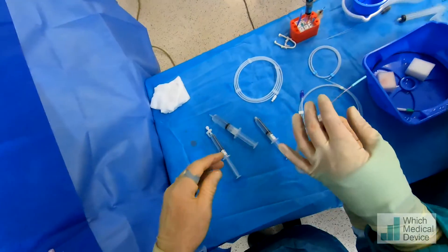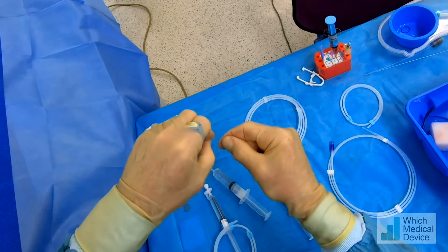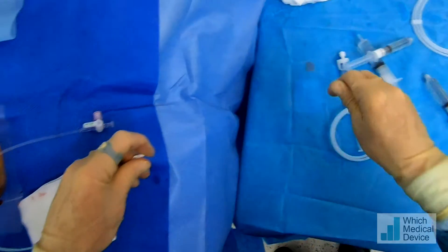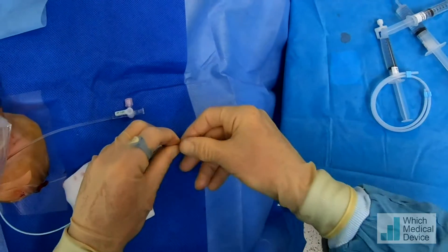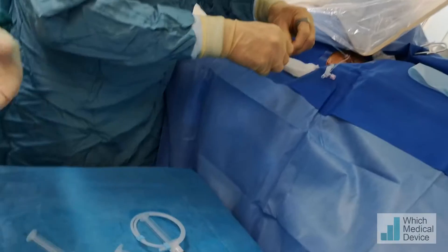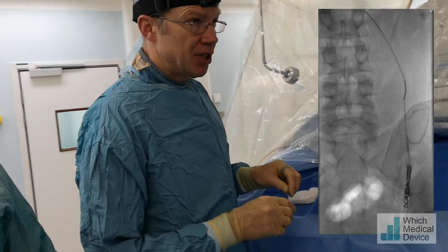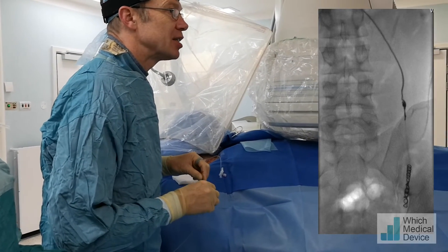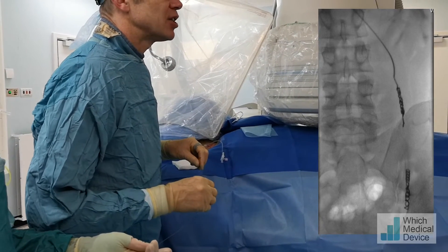I'll just take that out of its holder again. You can see it's on there — we're just going to take the end off that again. Take the syringe off, feed it into the catheter, take the central holder out, take the pusher out, and then advance with the straight end of the guide wire. This is actually a soft end on this double-ended guide wire. And you can see even in that small space, this coil is actually coiling up quite nicely just by a little bit of forward pressure from the guide wire. And that's it coiled up there.